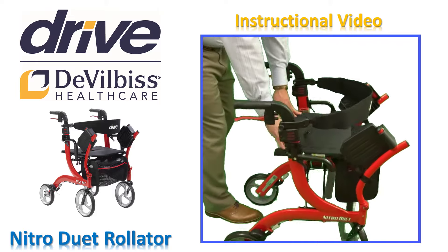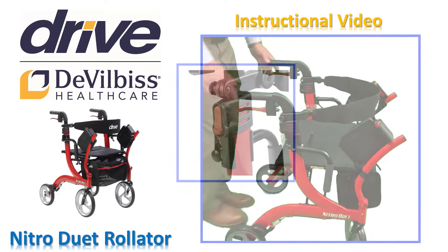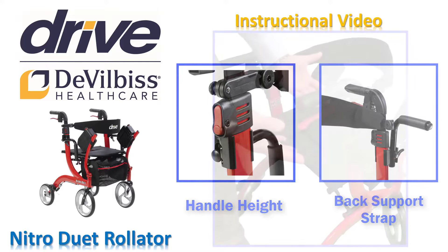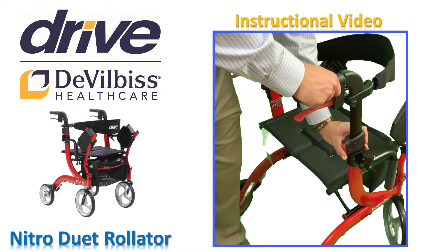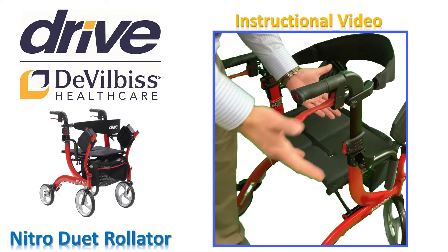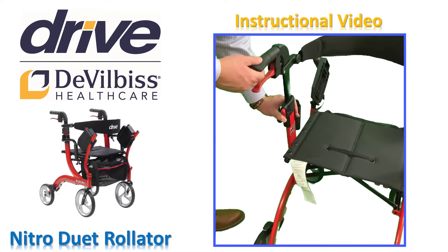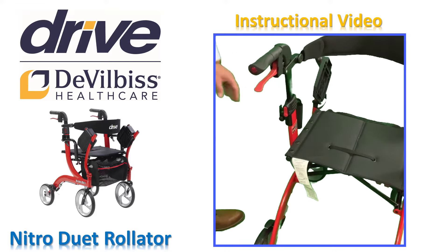For your safety, never use the Nitro Duet if not locked in the open position. We will now make two adjustments to customize your Nitro Duet to fit you properly and be the safest for your individual needs. First, the handle height. Press the red release buttons for hand grips and pull the hand grip upwards at the same time. As the handle moves, release the button — this automatically locks in the next possible height. Repeat this process until the desired height is reached on both sides.